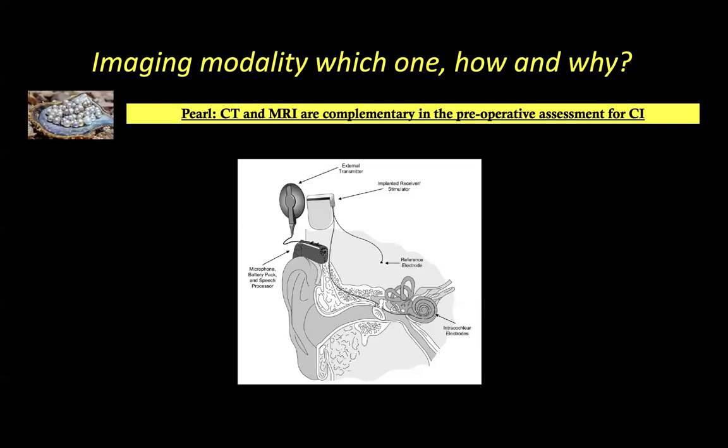So when we receive an MRI scan from another hospital of a child for pre-implant, a child who is not syndromic, so we do not expect too many surprises by way of pathological anatomy, and the nerve is there, and we can see on the MRI enough of the cochlea, then we do not repeat the CT and MRI to avoid the GA.